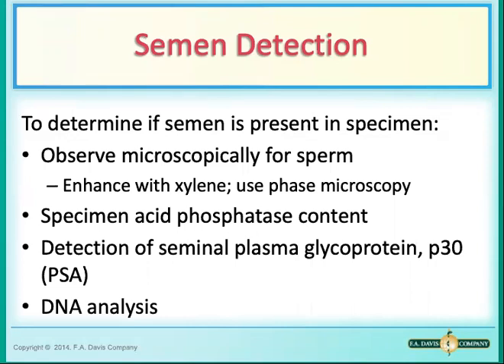The length of time required for complete sterilization can vary greatly among patients and depends on both the time and the number of ejaculations. Therefore, finding viable sperm in a post-vasectomy patient is not uncommon, and care should be taken not to overlook even a single sperm.